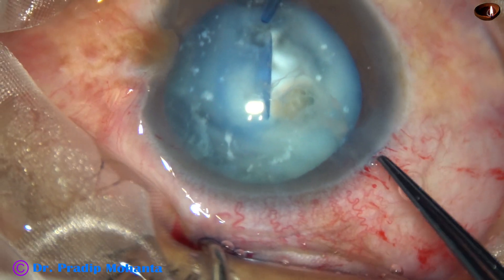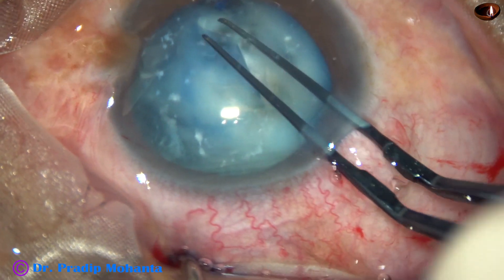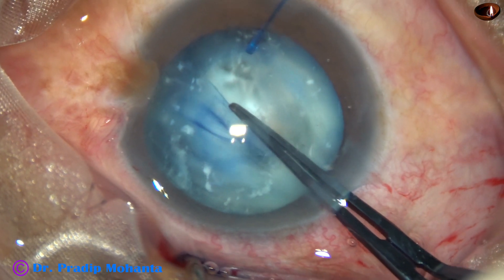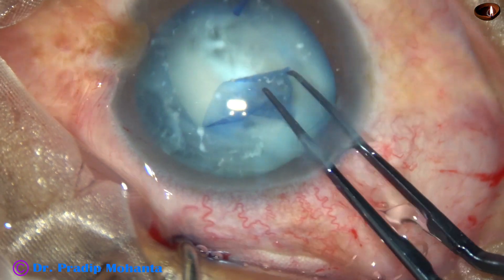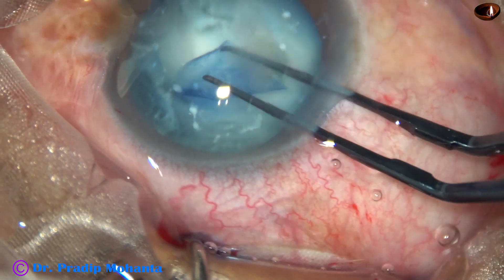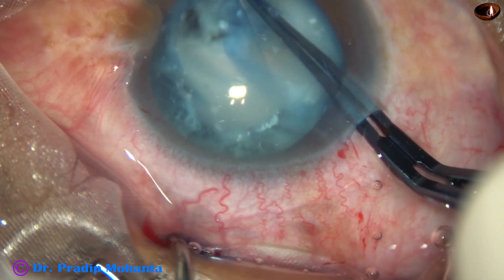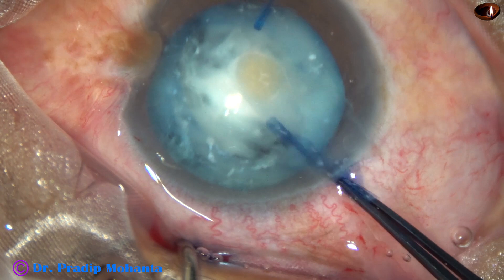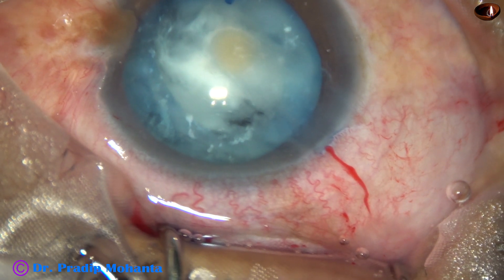Rhexis will now be possible and can be done safely. As I am pulling, the iris hook is pulling in the opposite direction — counter-traction — and this rhexis has become possible. This is a very nice technique: whenever you find that pulling the capsule causes a tendency of zonular dialysis, always apply an iris hook to provide counter-traction.